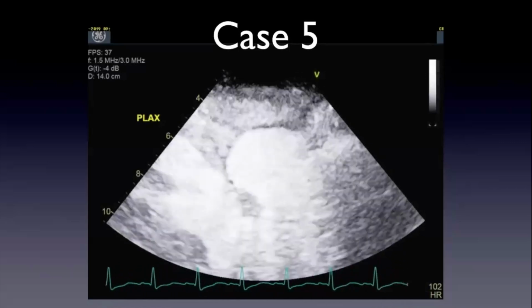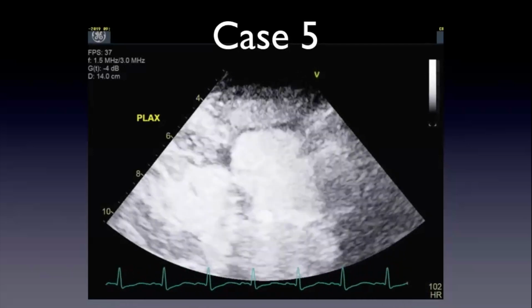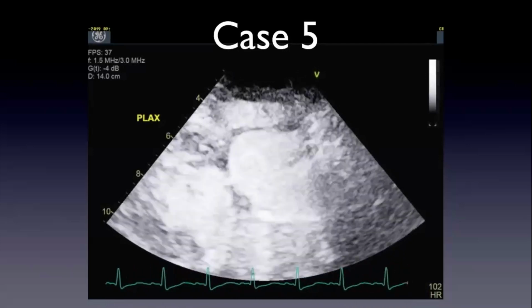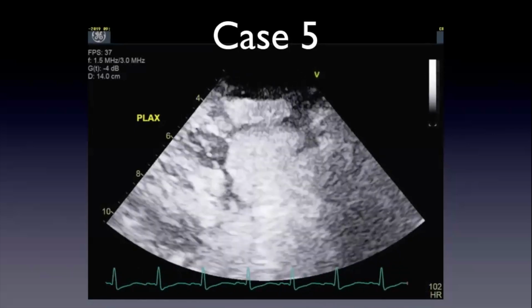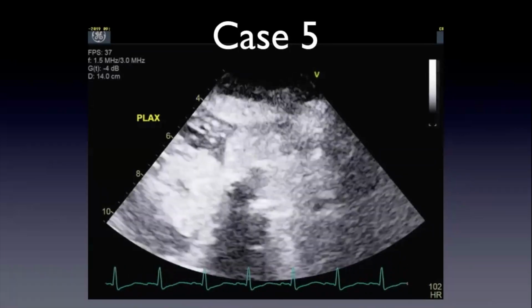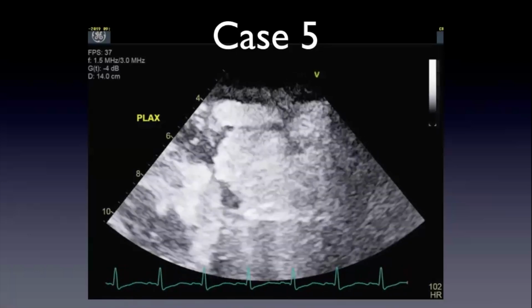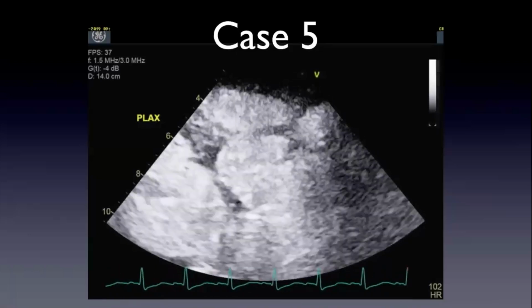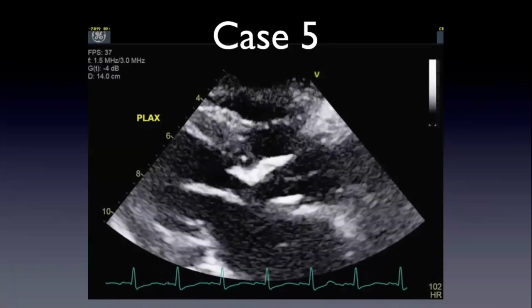What do you think the connection is? So this tests timing. This is a very important skill of a sonographer and echocardiographer, the temporal aspect, because it's all about moving. We always assess moving structures, right? So the temporal aspects become important. It's after the aorta. Yeah, exactly. So it's definitely after the LV, and it's after the aortic root's opacified, right? So the leak is really at the annulus, but the connection is to the root.